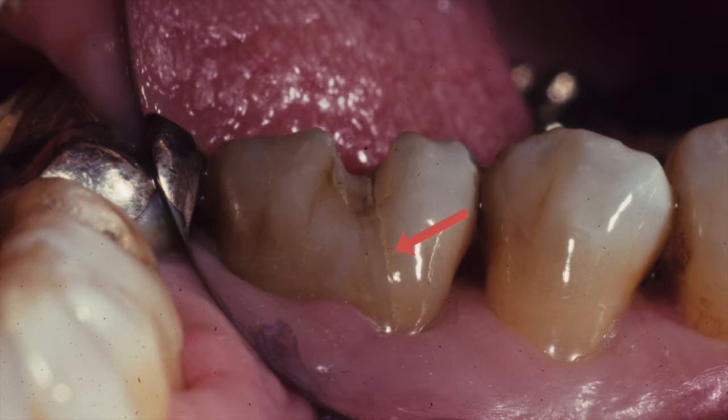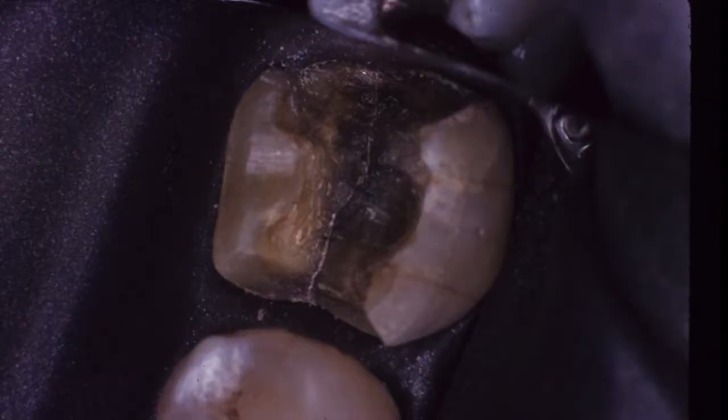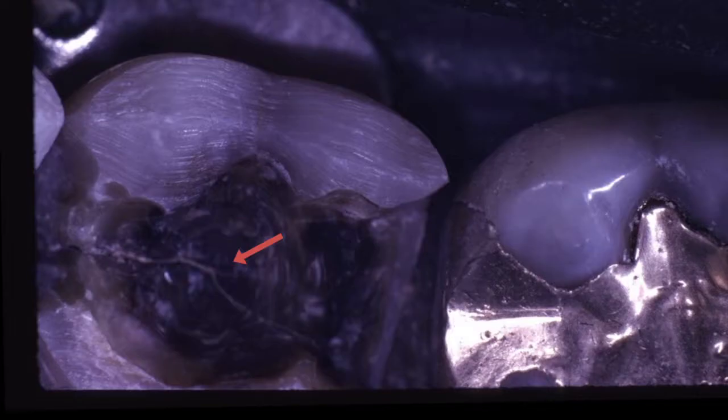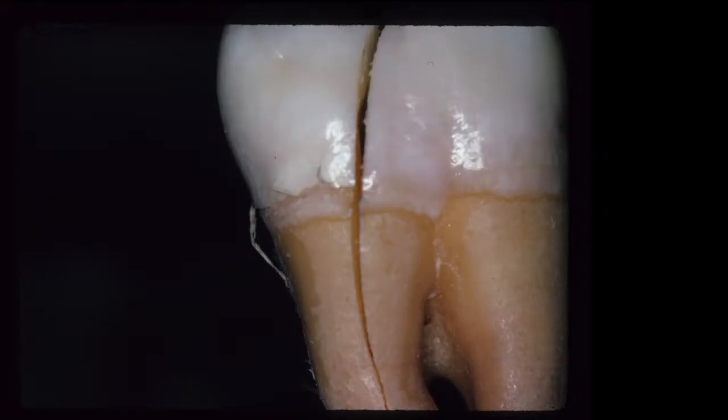This is a vertical crack which will likely go well below bone level. The most common crack you will see is the mesial distal fracture line under old amalgams or large restorations. This is a rather rare buccal lingual crack in an upper molar. This crack did not extend all the way across the floor. This one is interesting in that it followed the pulp canal all the way to the apex.